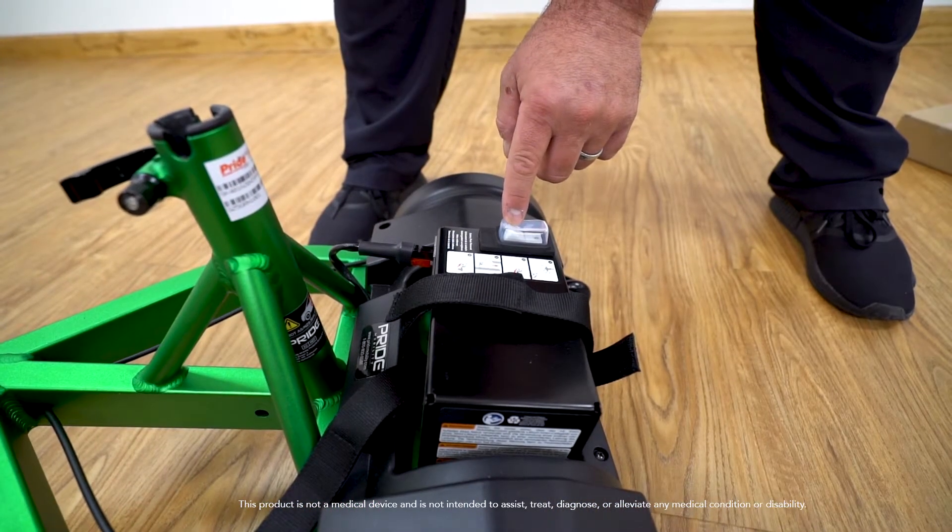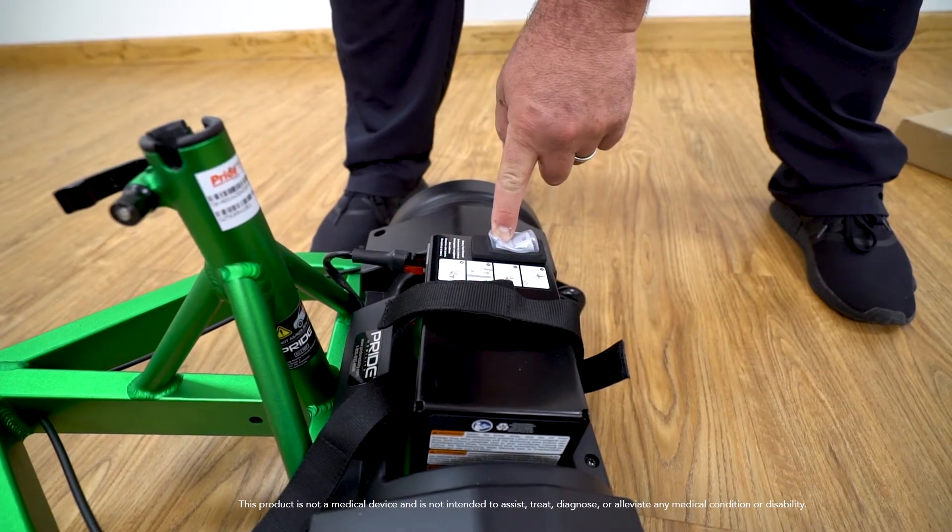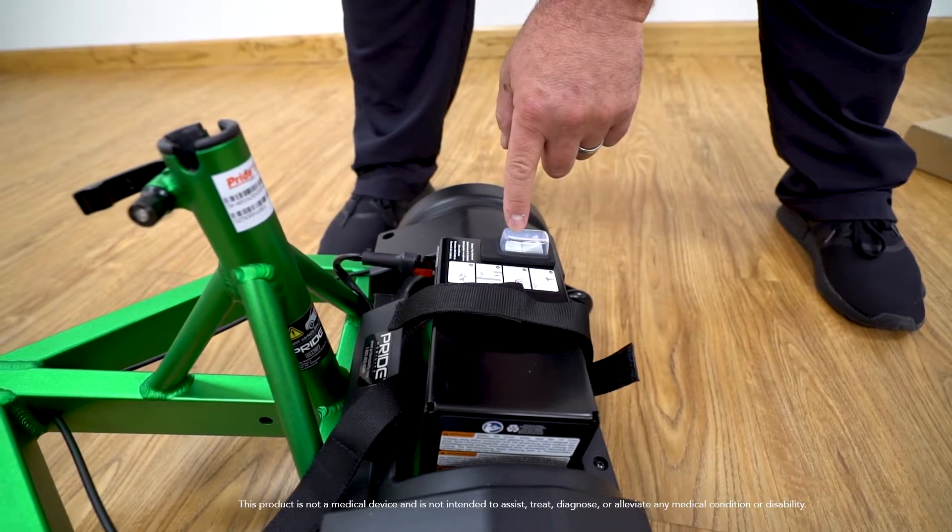To power up the unit, there is an on-off switch on the lithium-ion battery. The switch is also the circuit breaker for this unit.